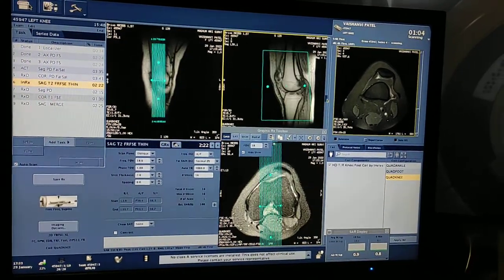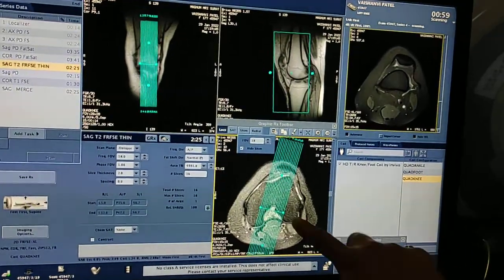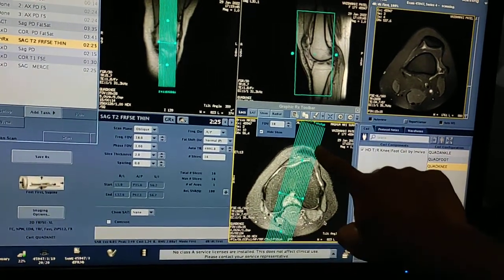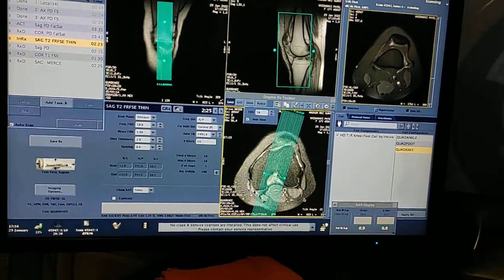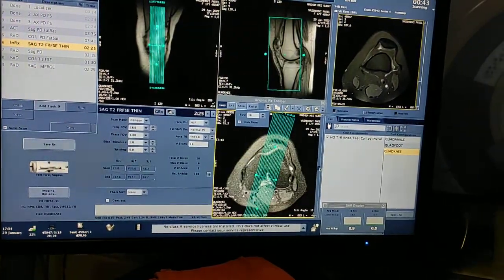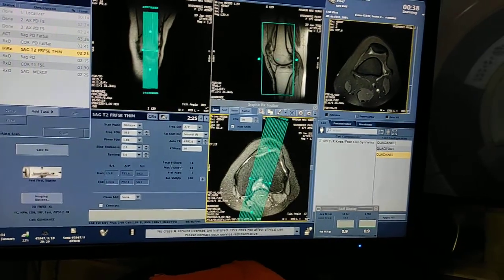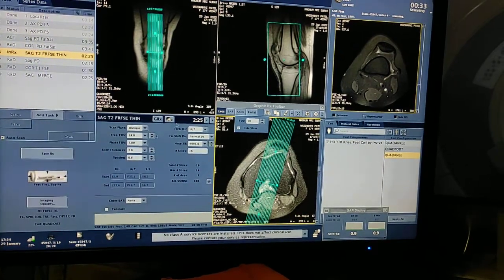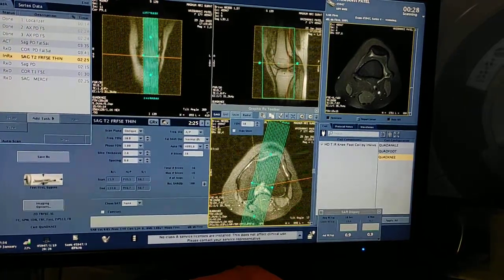The box is already ready. You have to oblique this sequence because in the axial images we can see the ACL is going at an angle, so you take perpendicular to that — you will get a good ACL image. I am taking this mainly for ACL only. The same thin sections are used for ACL and PCL tear — 2 mm thickness, zero spacing. Keep the shim on the images.